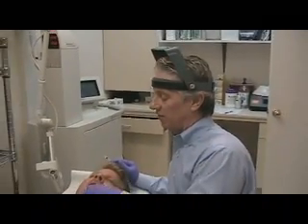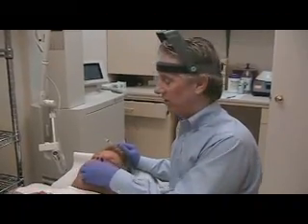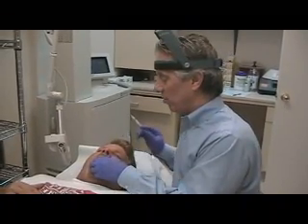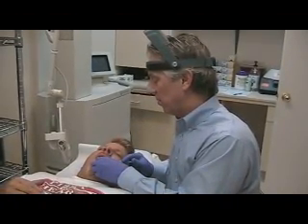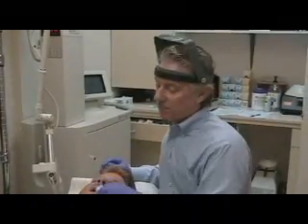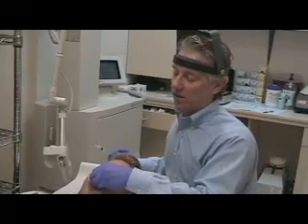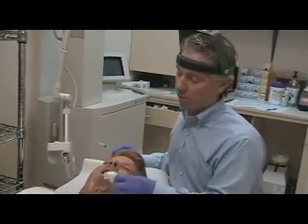I'm giving him a little bit of local anesthesia, but I can feel how rough and irregular this whole surface is. So even though he knows one spot, we're going to go ahead and treat the whole lips today. When we can visibly see a spot, there are probably many other spots that need to be treated as well, so you should just go ahead and treat the whole lip, because it's only a matter of time before the other ones will appear. This will help prevent any cancerous lesions from developing on the lip.